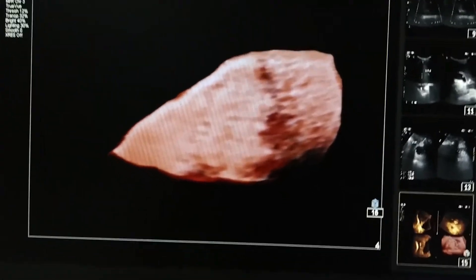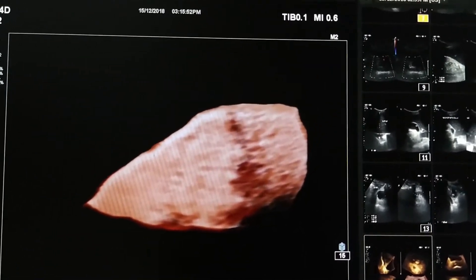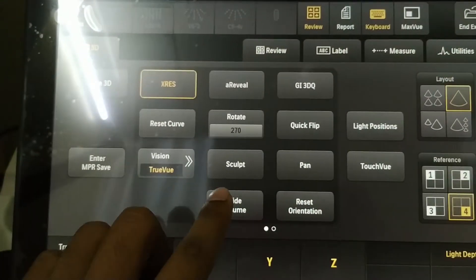Now I will cut the seminal vesicle from the sagittal section using the scalpel option of the machine.